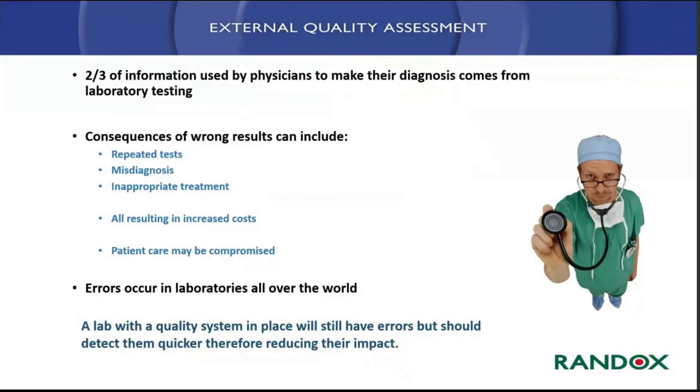It doesn't matter where you are in the world, from the most established laboratory to the smallest. I've been to laboratories all over the world, and I can assure you that they all have errors. So what we're talking about today is putting a quality system in place that will help to detect those errors quicker, therefore reducing the impact that any error may have.